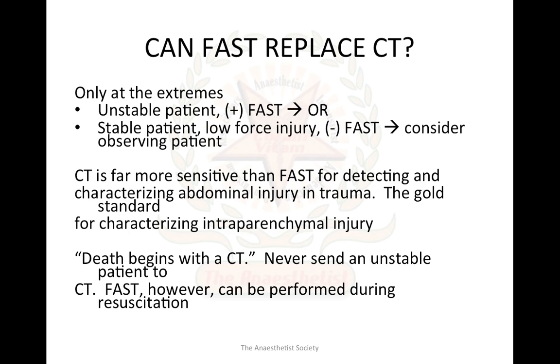CT is far more sensitive than FAST for detecting and characterizing abdominal injury in trauma. CT can give you all details. Where is the injury?